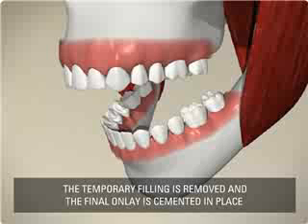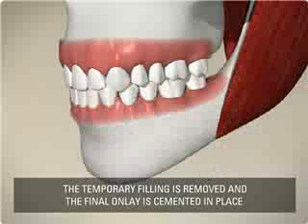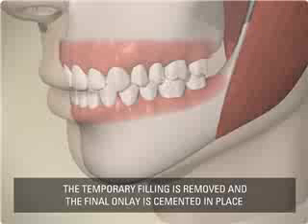When the onlay is ready, the temporary filling is removed and the onlay is cemented in place. Your dentist or hygienist will be able to answer any further questions you have about the procedure.